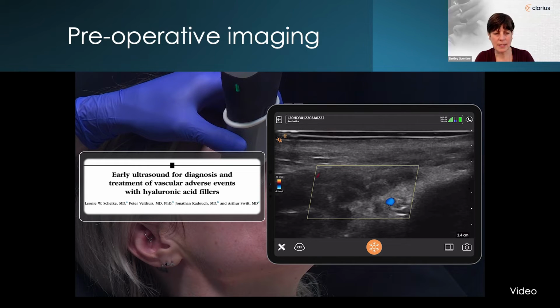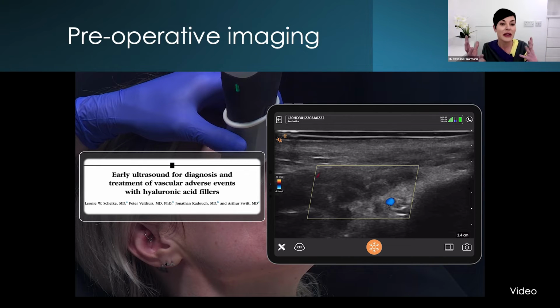Dr. MJ, is the hypervascularity just seen immediately after injection, or is this something that you see months down the road? This complication is 18 months old, and hypervascularity develops over time. If a vessel is being injured, or being irritated, the natural response is to try and recruit its friends to the area to give it more blood supply and to give it more help.